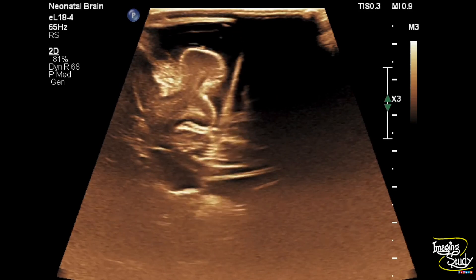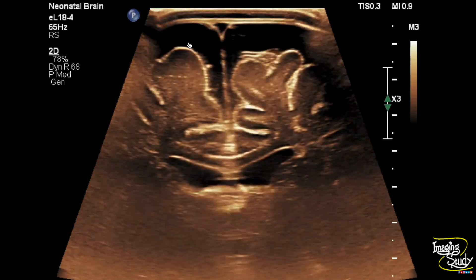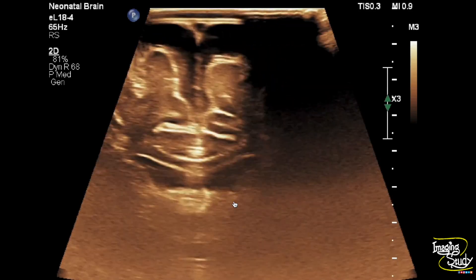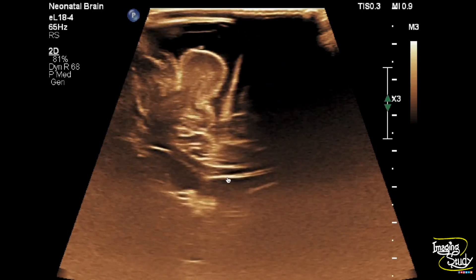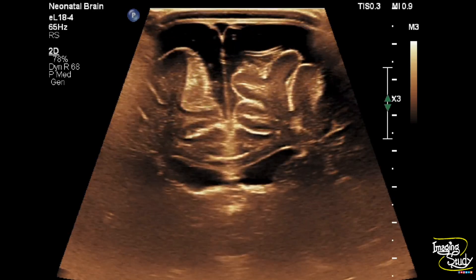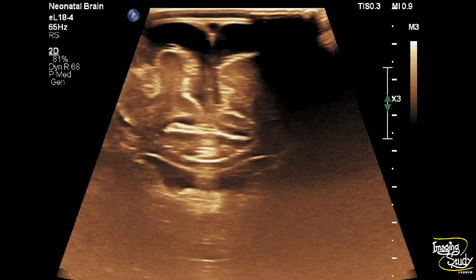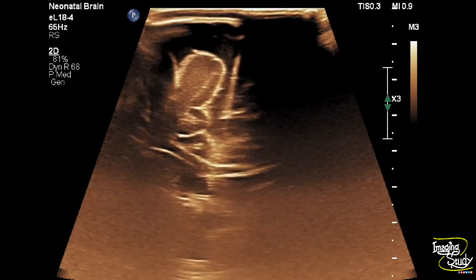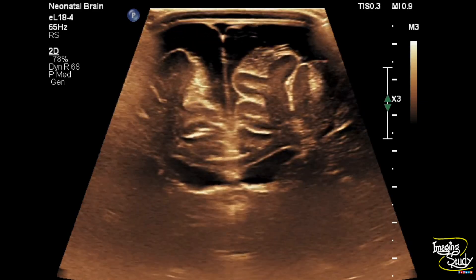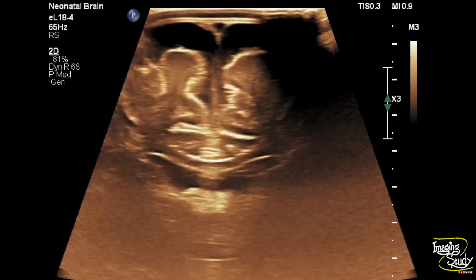On coronal section, you can see the wide subarachnoid space and prominent sulci. The ventricles are also prominent. This feature suggests a case of cerebral atrophy predominantly at the frontoparietal lobes, which was a consequence of hypoxic ischemic encephalopathy in this patient.